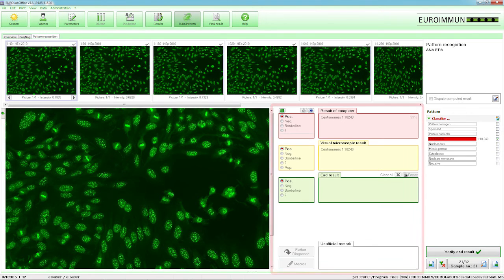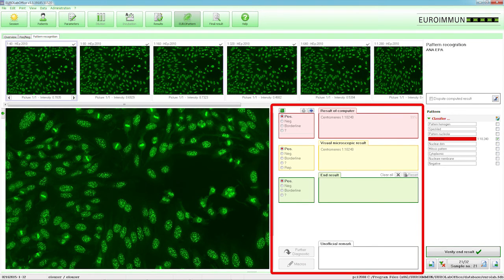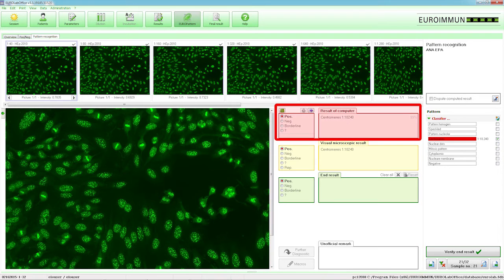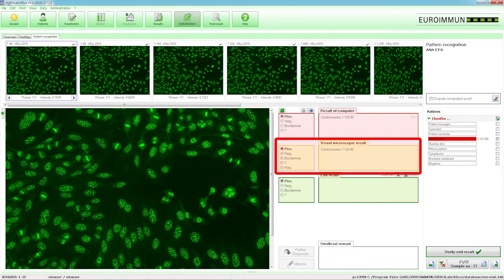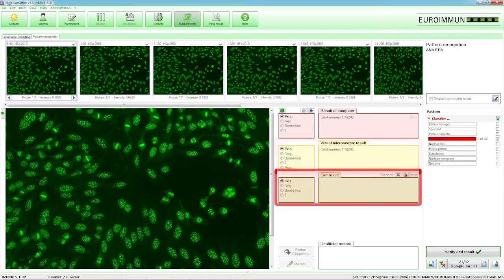In the Results area to the right of the magnified view, four differently colored fields are displayed: Result of Computer, Visual Microscopic Result, End Result and Unofficial Remark.